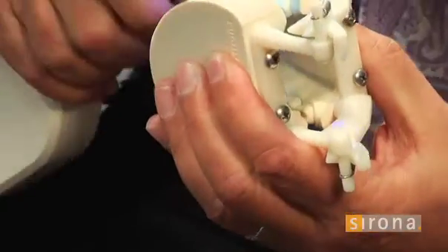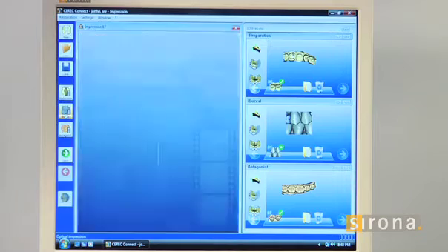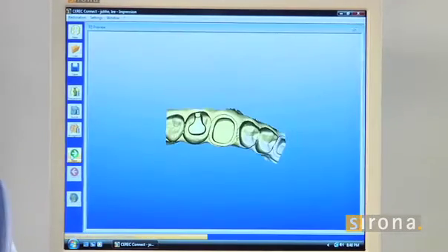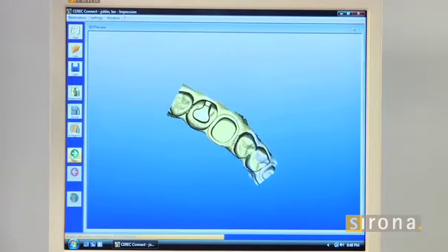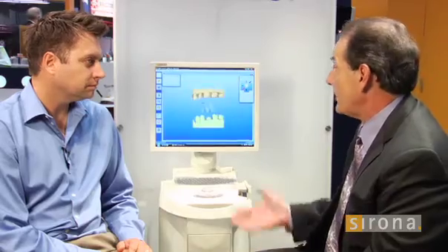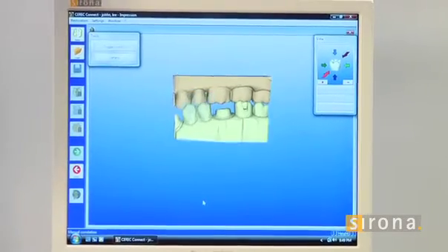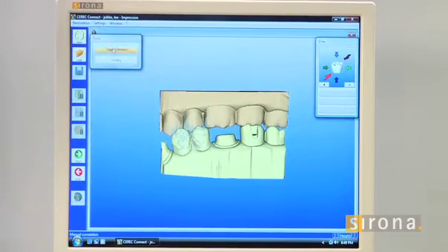Then I come in and go 90 degrees to the bicuspid area — really all I need is one scan there. Then we'll ask the software to start stitching the models together. We can look at the bite and how it's together. It's easily brought in, stitching and bringing it together — we just have to get it reasonably close and it figures out where it's supposed to be. So that's our models. Even though this is a handheld articulator, we can also see where the occlusion is here.